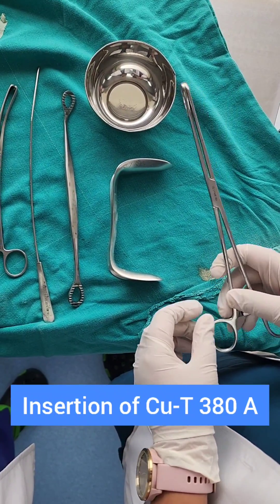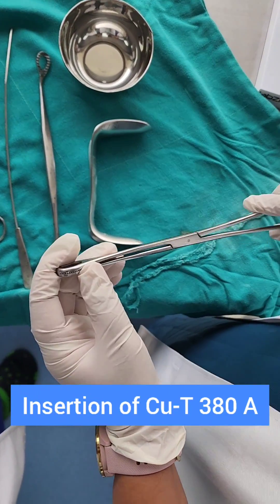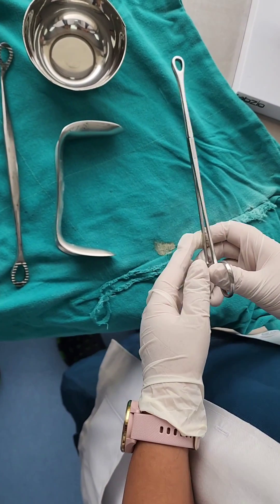We will show you how to insert a copper T. First we need to know the instruments used to insert a copper T.